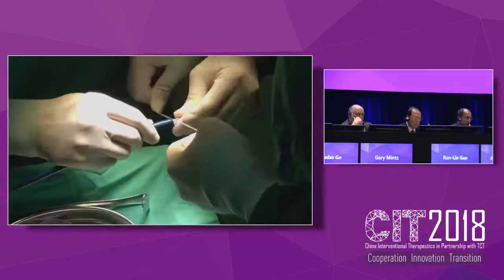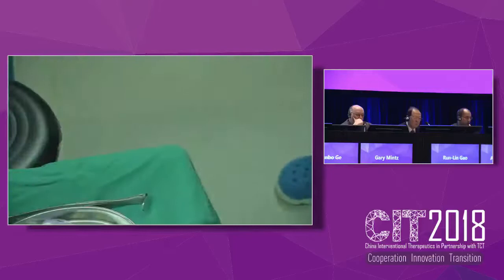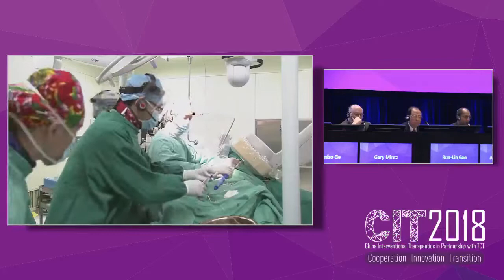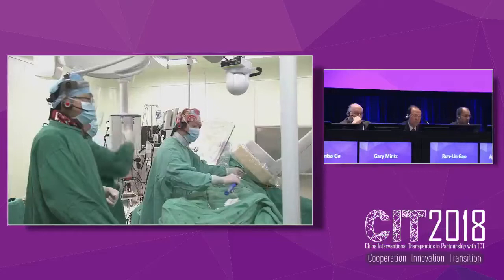Now we have finished reassembling the device. Then we check it. We check whether the mark is in the right position or not. Okay? Yes. Okay, so the mark is in the ideal position, then we flush it.